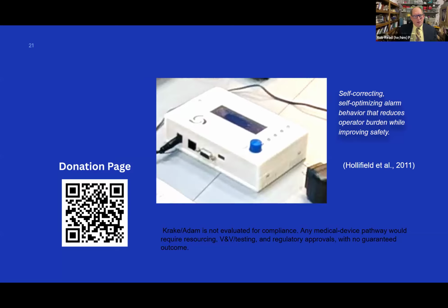Now, a medical device as complicated as a ventilator is life critical. When someone is being mechanically ventilated, the machine is responsible for keeping them alive. It is absolutely necessary for such a complicated life critical machine to have alarms.